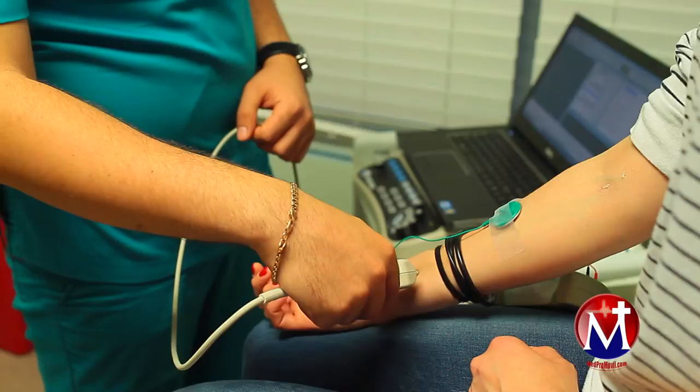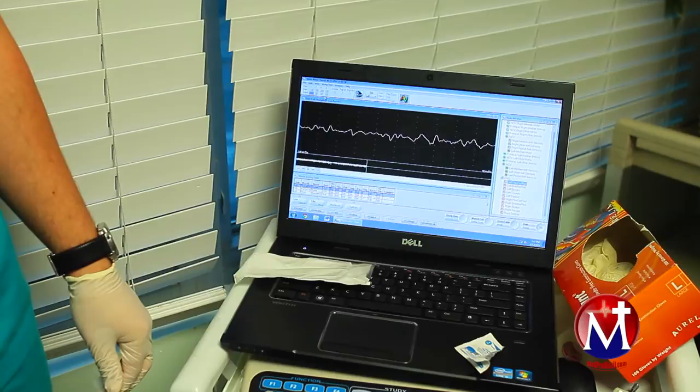What you have to do is put two electrodes on a nerve and stimulate the nerve and get the response at a distance. By reading that response, a specialist or a subspecialist like a pain doctor or a neurologist can figure out what the problem is. There are a lot of indications of NCV and EMG. For NCVs, the indications could be peripheral neuropathy, diagnosis of suspected generalized neuropathies like diabetic neuropathy, carpal tunnel syndrome, spinal disc herniation, or any kind of traumatic nerve injury. All these things can be helped by the diagnostic procedure, nerve conduction velocity or NCV.